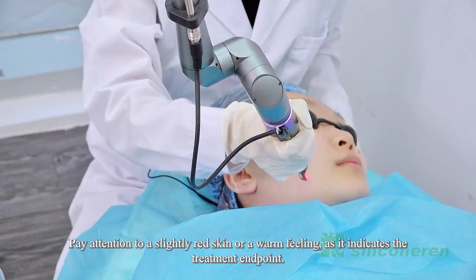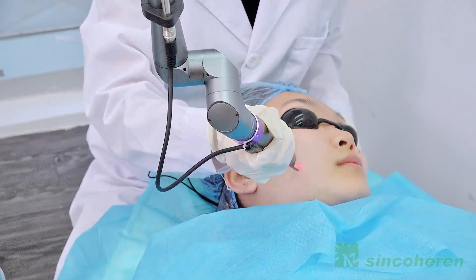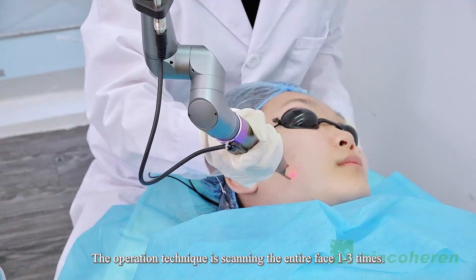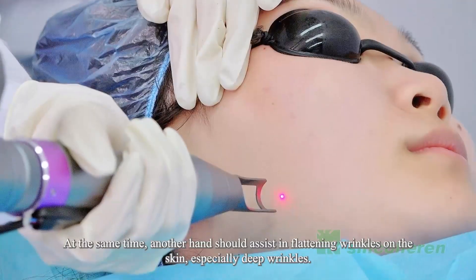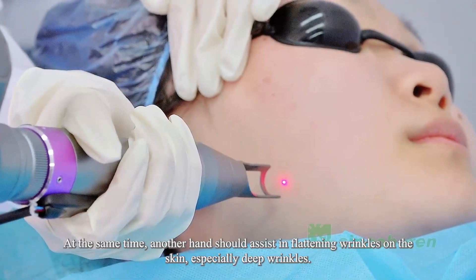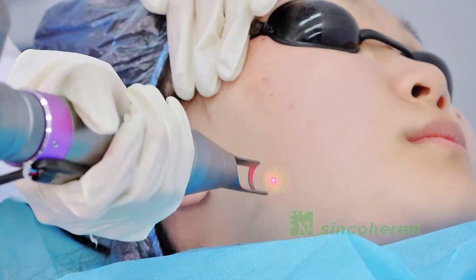The operational technique should involve vertical or circular scanning from bottom to top and from inside to outside. Pay attention to slightly red skin or a warm feeling, as it indicates the treatment endpoint. The technique involves scanning the entire face one to three times. At the same time, another hand should assist in flattening wrinkles on the skin, especially deep wrinkles.